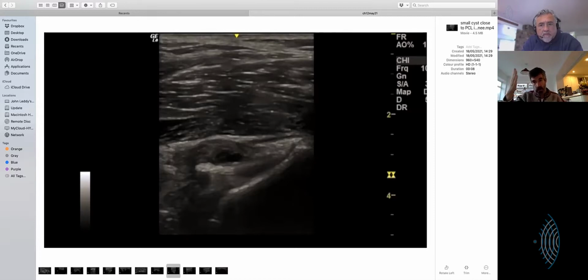As you go around the back, it's nice and fat, and what you'll find is that if you lift the knee slightly, lift the foot slightly, but with the hamstring staying relaxed, you'll then find that the triangle of cartilage moves posteriorly, and you can often see that quite well. Not necessarily to be able to diagnose it, but it makes a nice picture. But anyway, the tibial plateau stays as this nice level cut-off like this. So you follow it around like that, and then suddenly it does that.